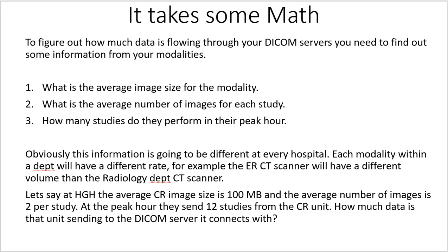It takes some math. To figure out how much data is flowing through your DICOM servers, you need to find out some information from your modalities. 1, you need to know what is the average image size for the modality. 2, what is the average number of images for each study. And 3, how many studies do they perform in their peak hour.